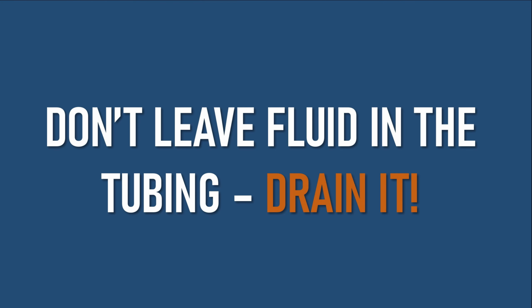Don't leave fluid in the tubing. Drain it. This is something I see all the time. It's one of the misnomers that you see in the ICU, that it's okay to have fluid in the tubing because you can see it oscillating back and forth like this. But this is incorrect. Remember, for conventional chest drains, we are draining both fluid and air, and a moderate air leak will not pass through several centimeters of fluid, which acts like a bung. So the fluid needs to be tipped into the drain at regular intervals.